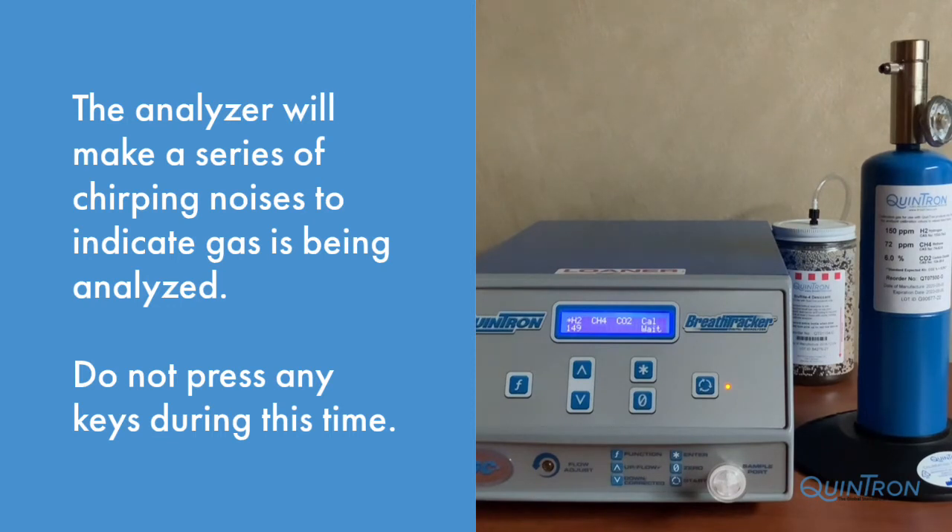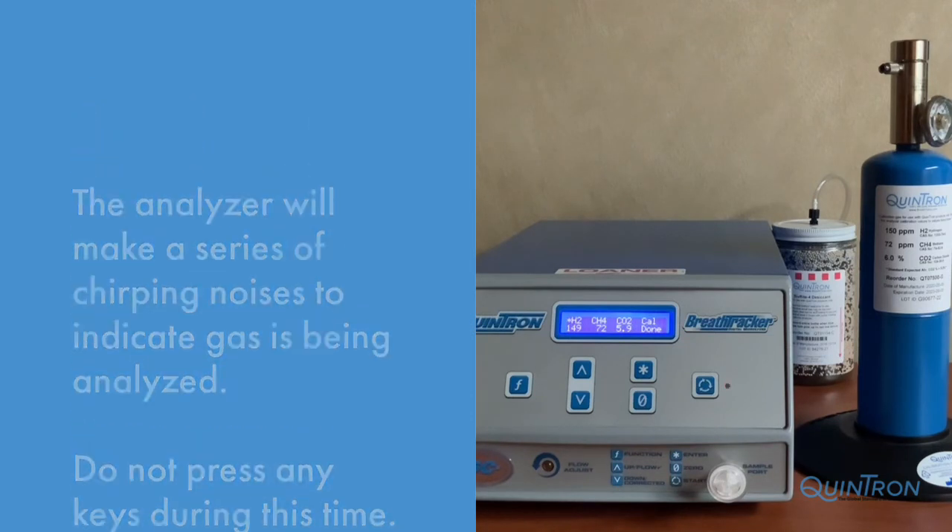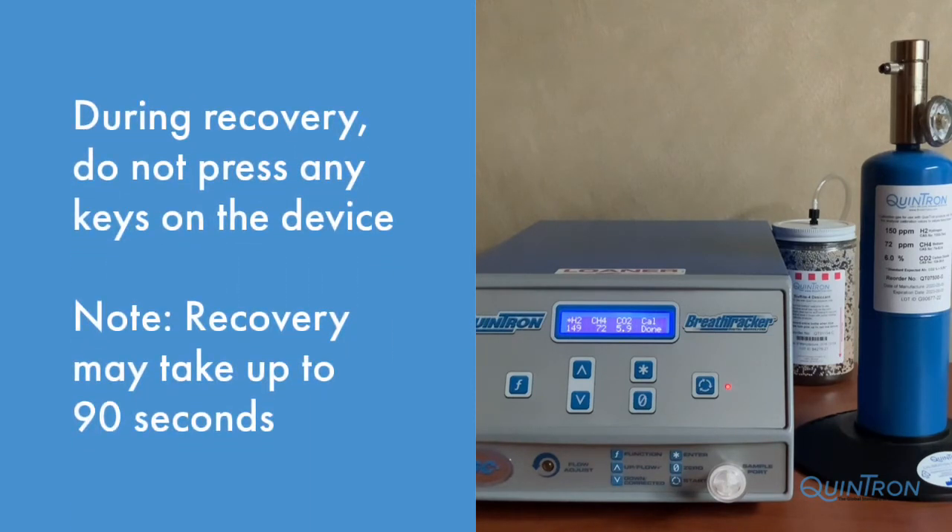Once calibration is complete, the status light will begin blinking and the display will read Cal Done. During this time, the analyzer is in a recovery process where it's removing the previous sample and bringing the machine back to its baseline. Do not press any keys until the light blinks green.